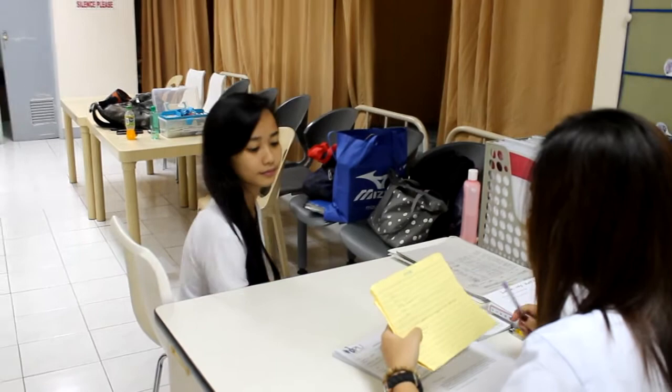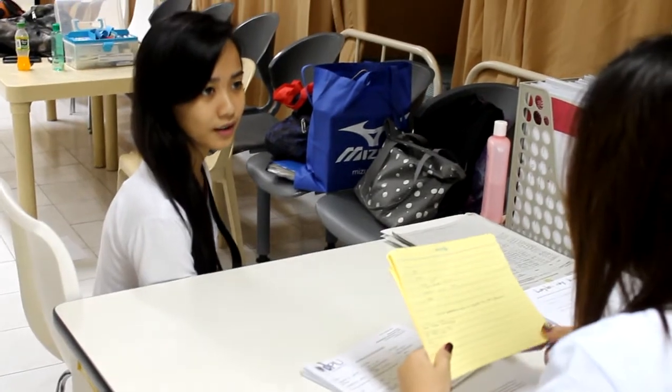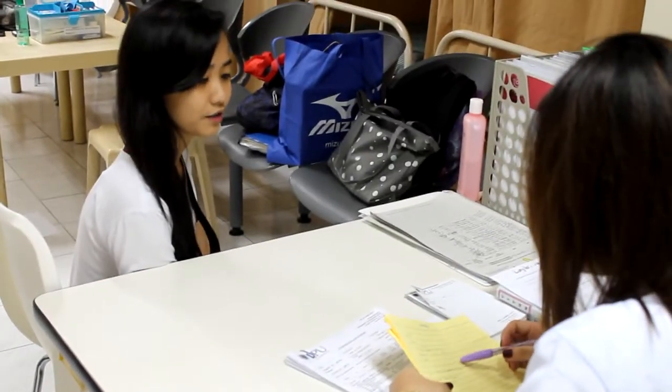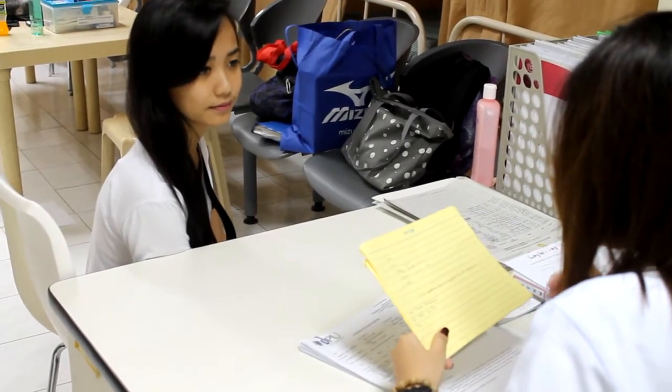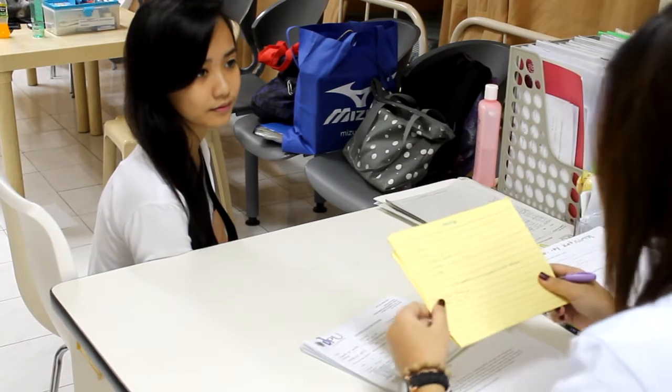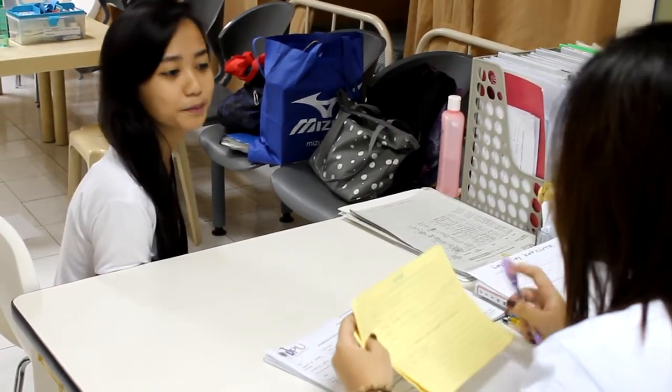Introduce yourself. Identify the patient. All patients are called into the phlebotomy area and asked their name and date of birth. This information must match the requisition form. Explain the procedure and gain consent from the patient. Verify the patient's condition and check for any allergies.